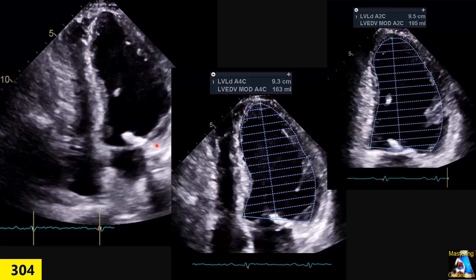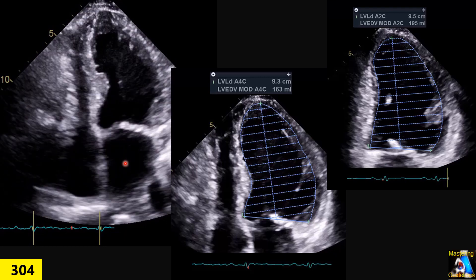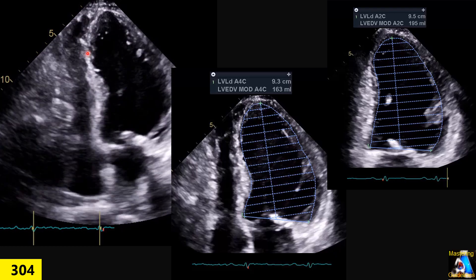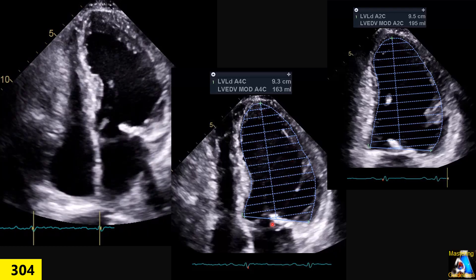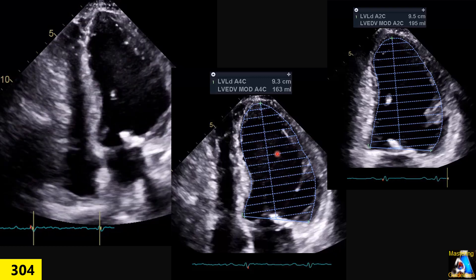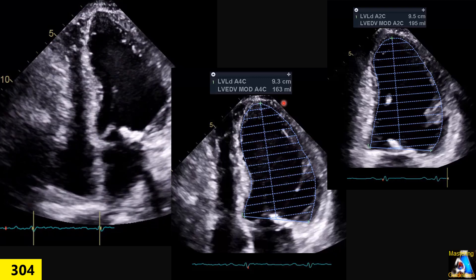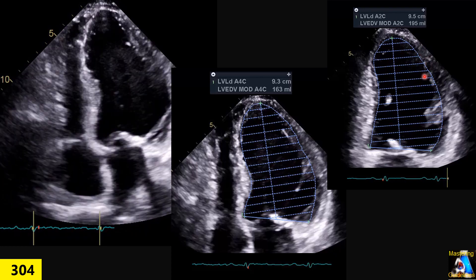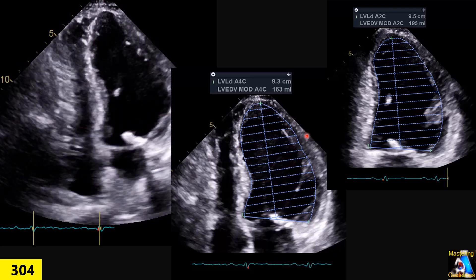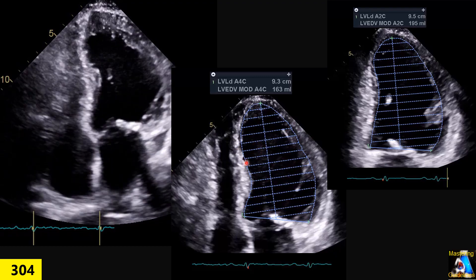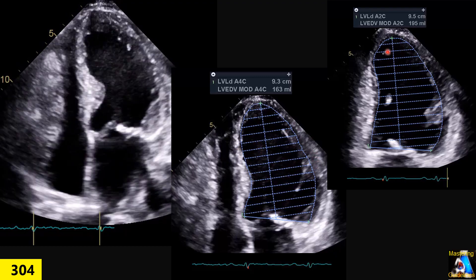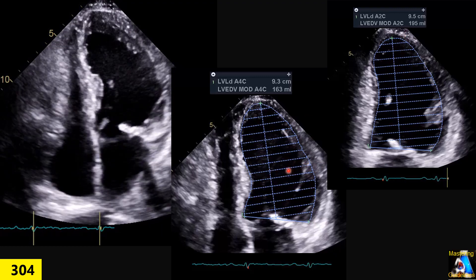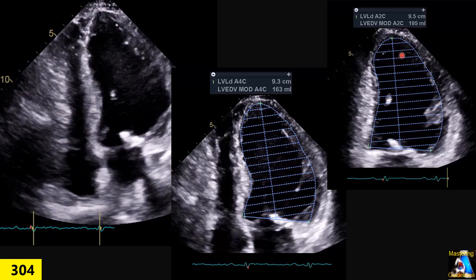The patient's left ventricular volume was measured at the apical 4-chamber view, as you can see. The left ventricular end-diastolic volume measured 160.3 milliliters in the apical 4-chamber view, and 195 milliliters in the apical 2-chamber view. Are either of these correct or wrong? How do you explain this discrepancy between the apical 4 and apical 2 views?